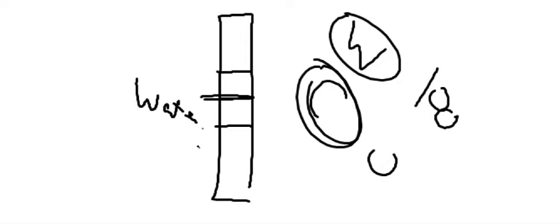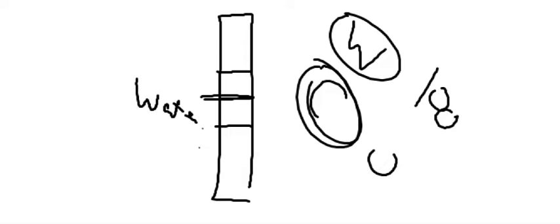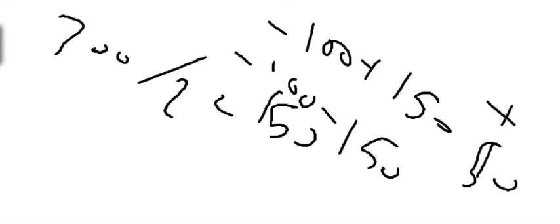But from which shade to which shade? From which Hounsfield unit to which Hounsfield unit? Plus 50 to minus 250. Exactly. What we will do is the following. When I tell you window center of minus 100 with a window width of 300, we divide the 300 by 2, which equals 150. The window center is minus 100, so minus 100 plus 150 is 50, and minus 100 minus 150 is minus 250. So this is our window, 50 to minus 250. Did we understand?